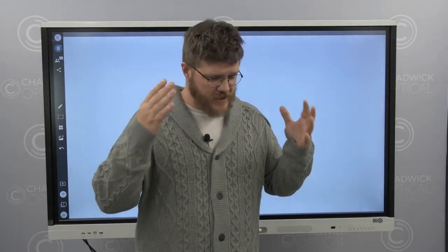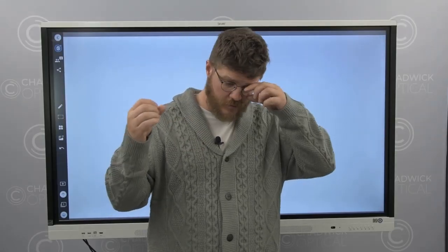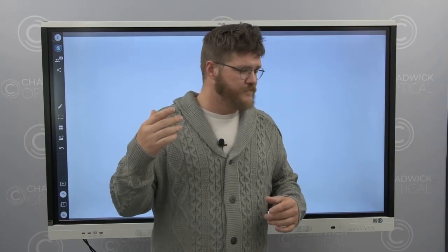With a handheld magnifier, that could not be wronger. It's just dead wrong. Now, when we're talking about X with a binocular or a telescope, it is a very accurate means of measuring magnification.